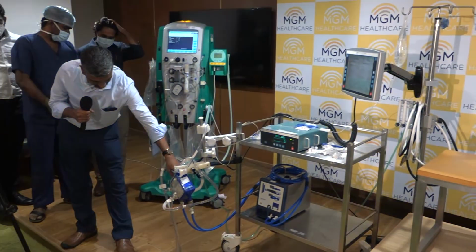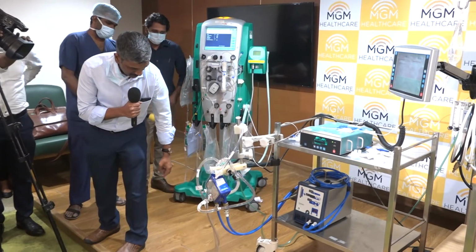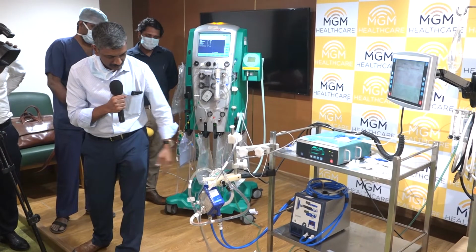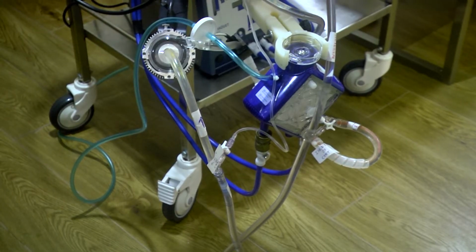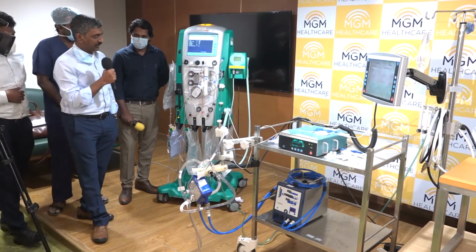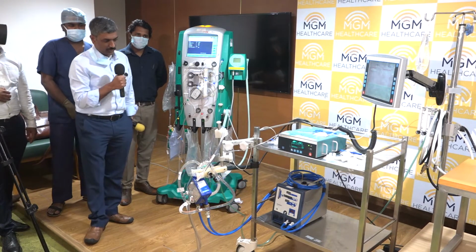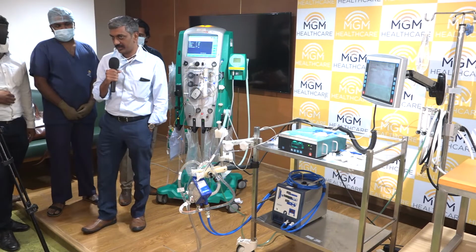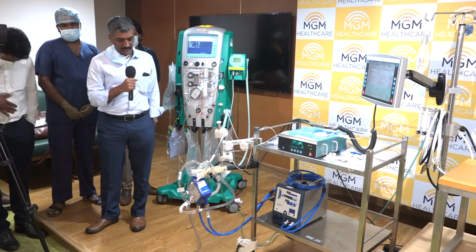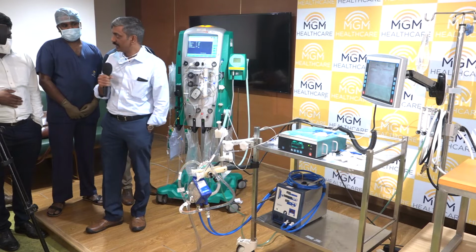What we usually do is take the access line post-pump, pre-oxygenator, and return it in the pre-pump. Since you're returning pre-pump, even if clots are there, they get filtered in the oxygenator. The main issue with connecting CRRT and ECMO is always the pressure problems. If the pressure is high or low, the CRRT is always disrupted. So to avoid this, we try to manage and clamp the line partially and do such maneuvers.